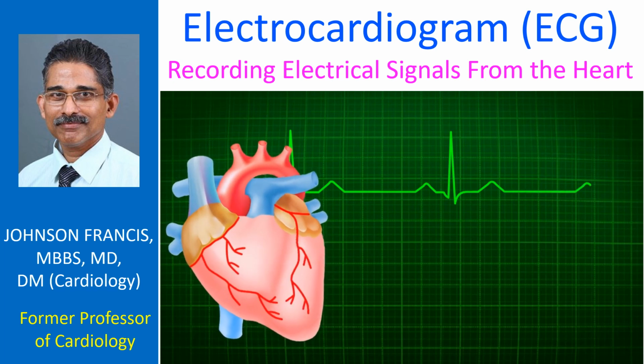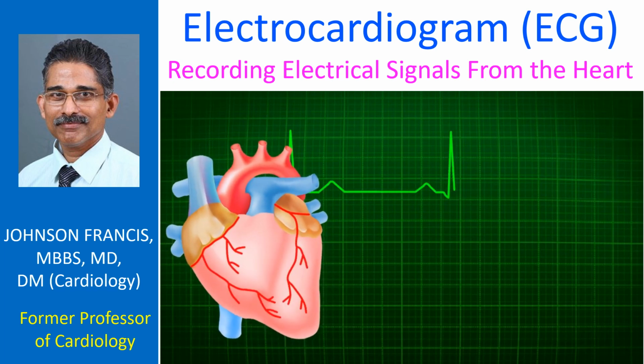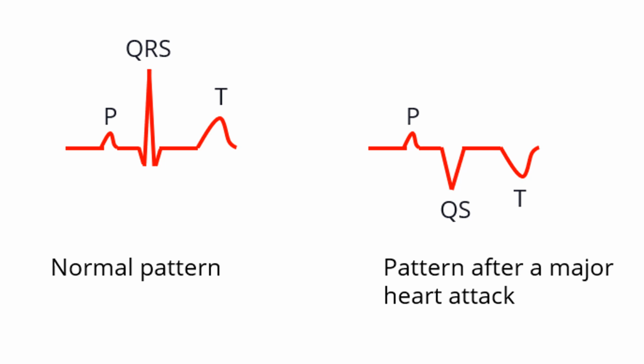ECG is an important part of cardiac evaluation, especially in the emergency room when someone presents with chest pain. In spite of the availability of many modern high-tech investigations, the role of a simple ECG in the diagnosis of acute myocardial infarction, heart attack, still holds good.